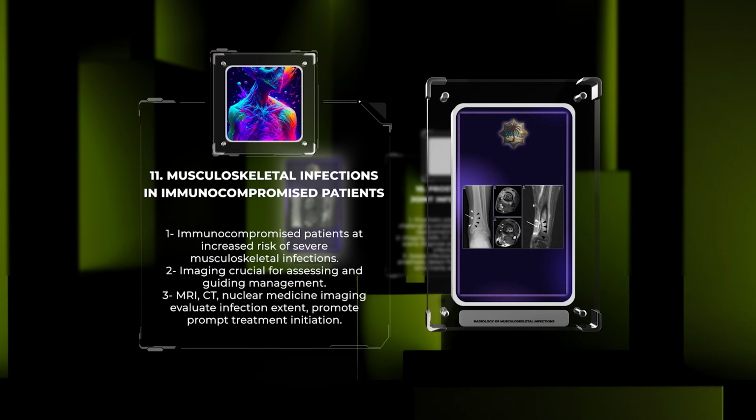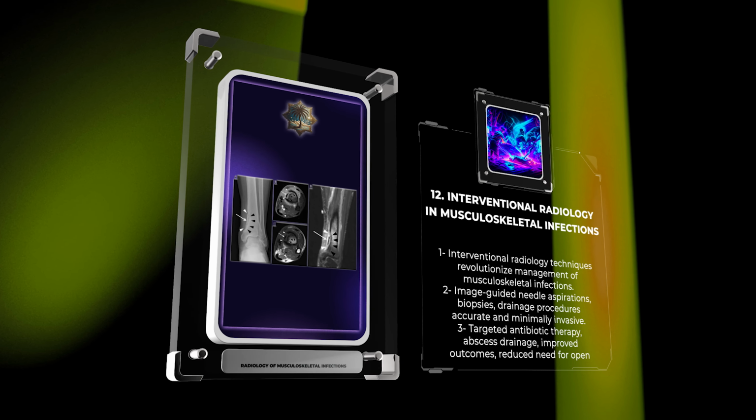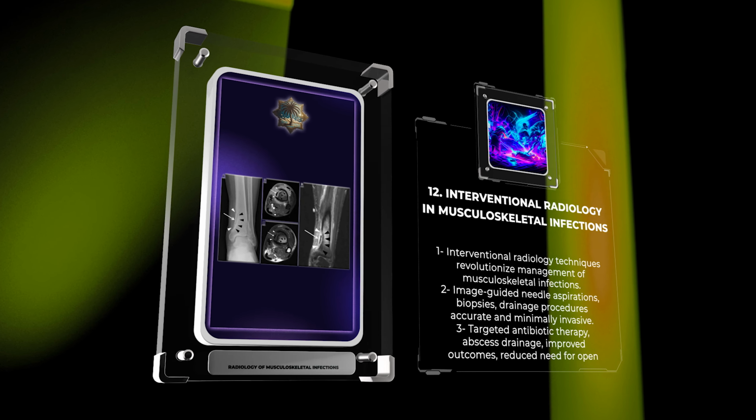Interventional radiology techniques, including image-guided needle aspirations, biopsies, and drainage procedures, have revolutionized the management of musculoskeletal infections. These minimally invasive procedures provide accurate diagnostic information and allow targeted antibiotic therapy or drainage of abscesses. Interventional radiology has significantly improved patient outcomes and reduced the need for open surgical interventions.